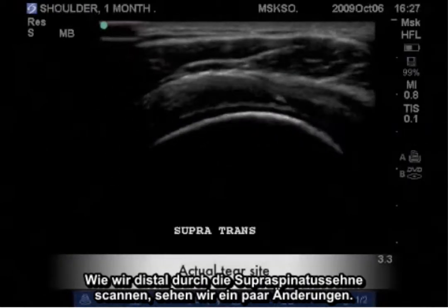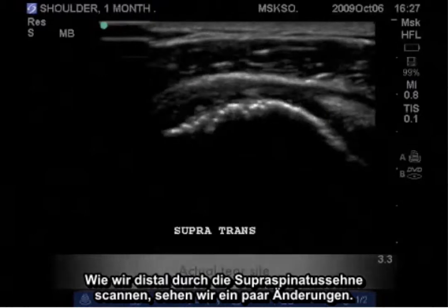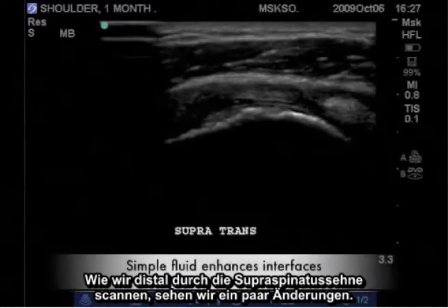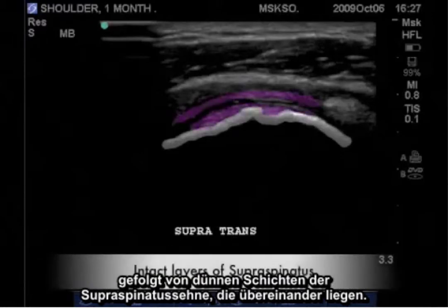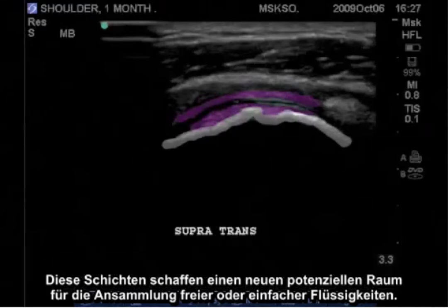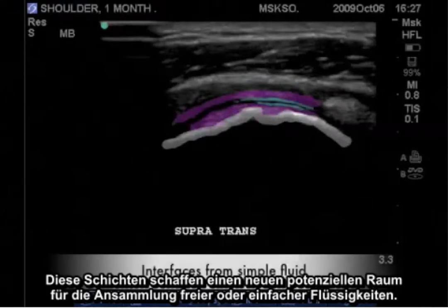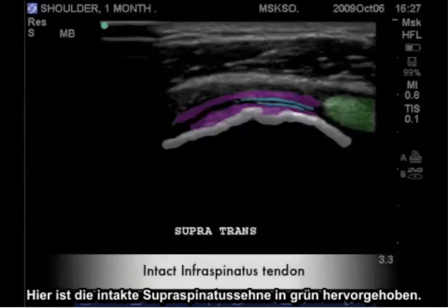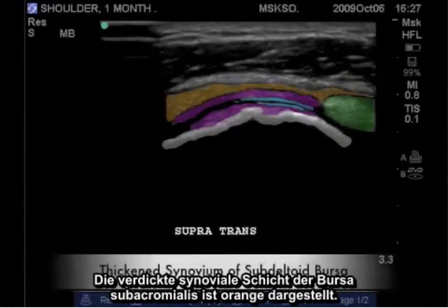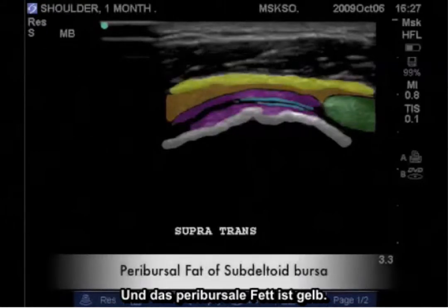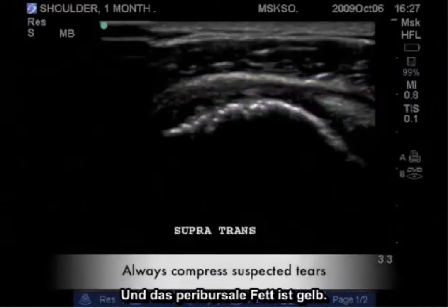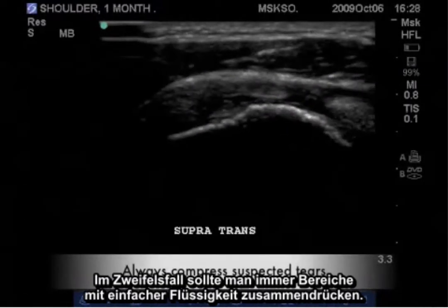As we scan distally through the supraspinatus tendon, we see a few changes. There is a disruption in the bony cortex, followed by thin layers of the supraspinatus tendon resting on top of each other. These layers create a new potential space for free fluid or simple fluid to collect. Highlighted here in green is the intact infraspinatus tendon. Orange represents the thickened synovial layer of the subacromial bursa, and yellow is the peribursal fat. When in doubt, always compress areas of simple fluid.